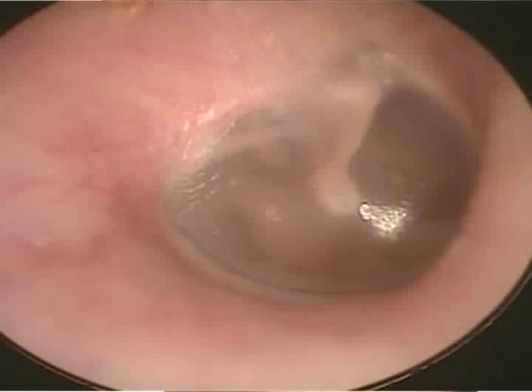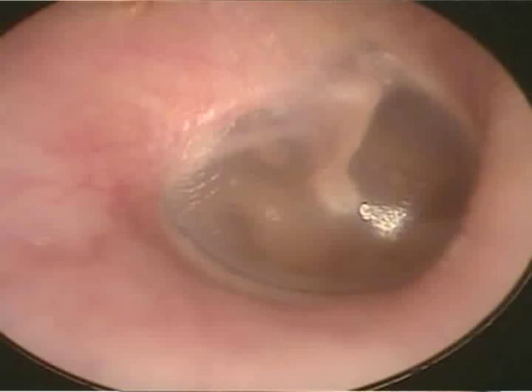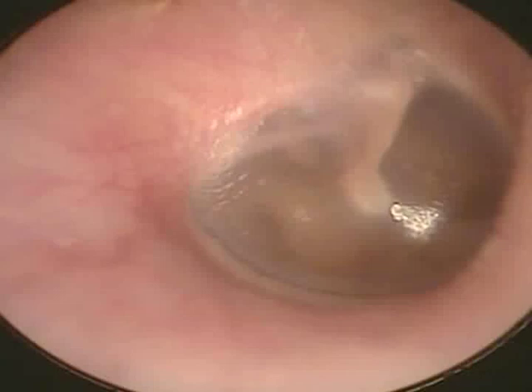We also look to see if sections of the malleus bone are visible. The malleus bone is attached to the inside of the tympanic membrane in the middle and has three sections. It is the handle of malleus and the short process of malleus, which comes out on the tympanic membrane like a tip. These must be visible through the otoscope.